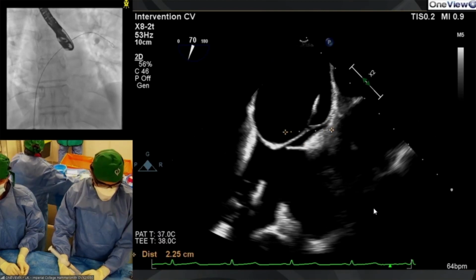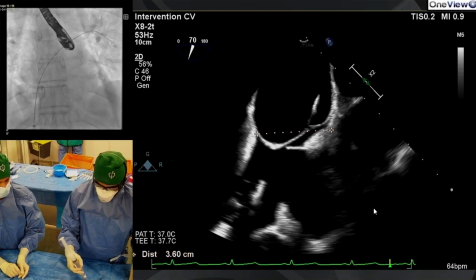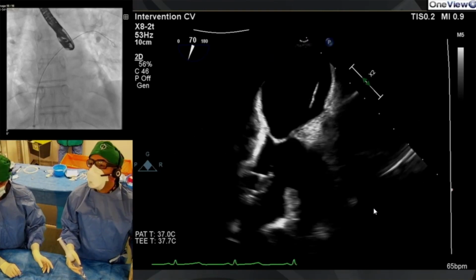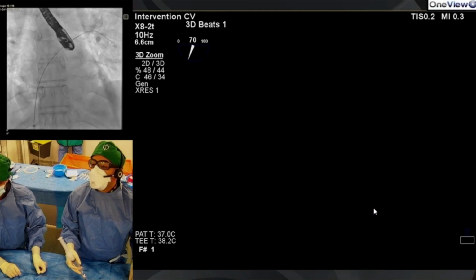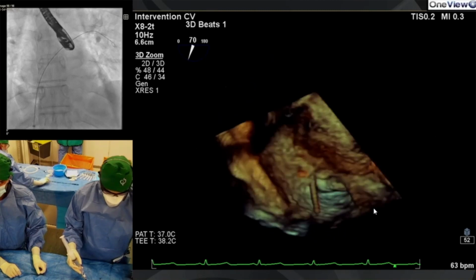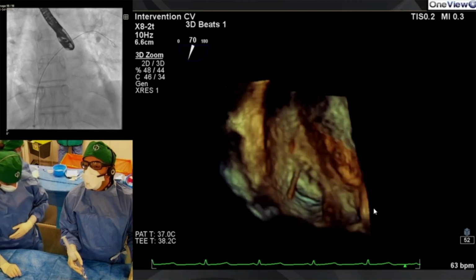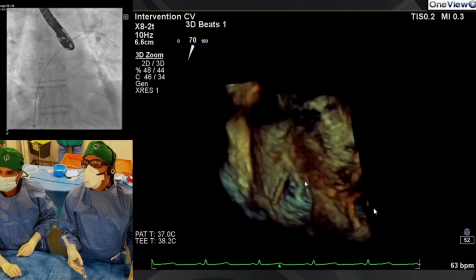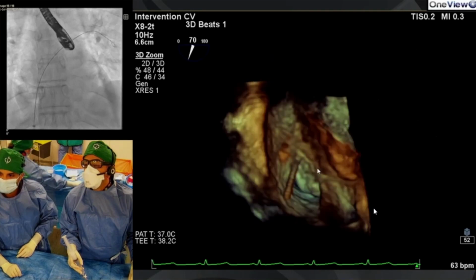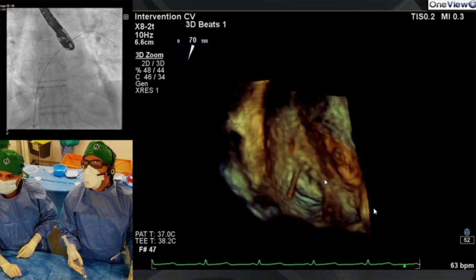So, Dave, on your point on the size of the disc, so there's the atrial septum, 36 millimeters, but the point about the space, if I can just show you the 3D again, our worry here is that actually, if you look, the wire's gone through. This is a RA view. We've got this ridge coming up, and sorry, let me just orientate this 2 seconds, just a bit better. So we've got the ridge coming up here at the bottom there, and we've got the aorta here, and this is the space you have. So you've got 18 millimeters opening. And if I just freeze that, our concern is that you don't have much space here for the disc to sit flush on the septum.